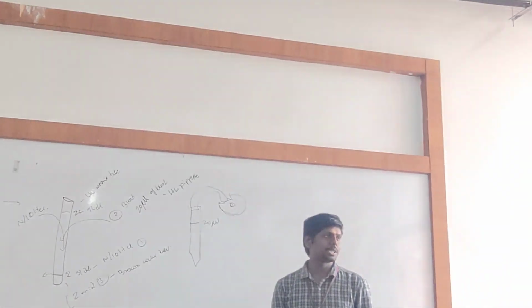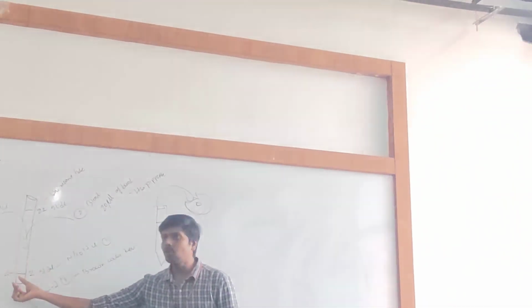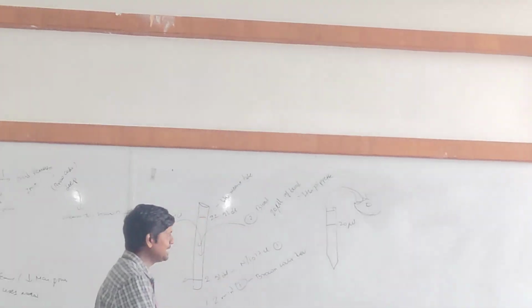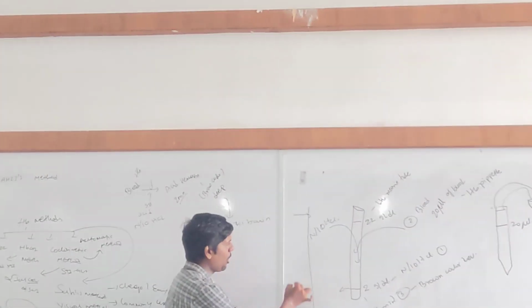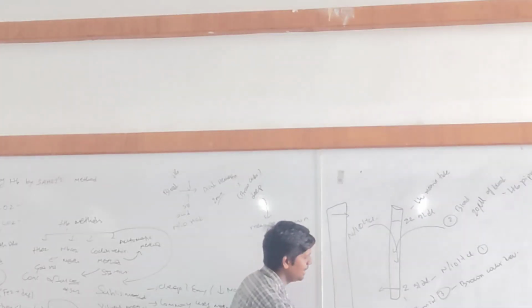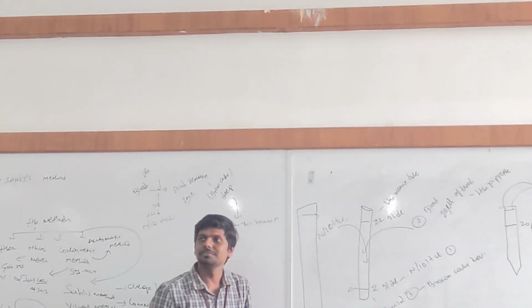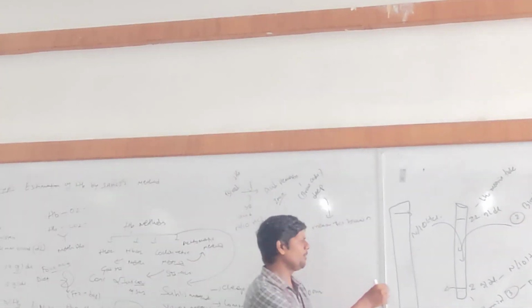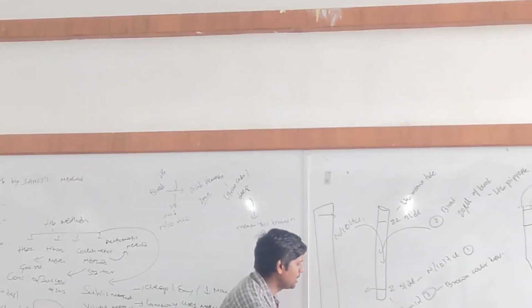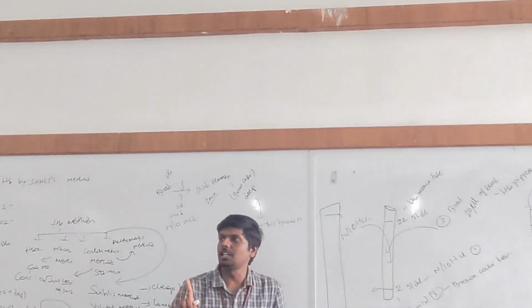Next comes a very interesting feature. This is a deep brown color. Now, Sahli took one coffee color filter. He has universally standardized one standard color, a standard color filter. I used coffee, but coffee is not the right term.